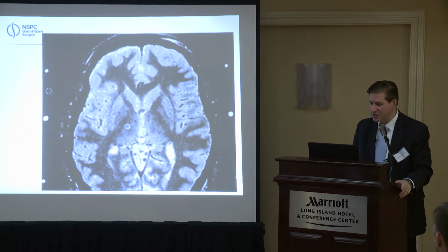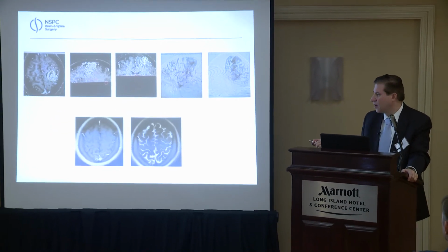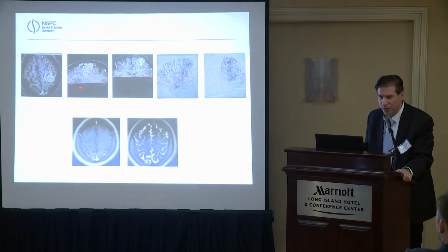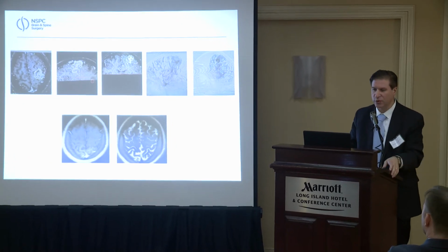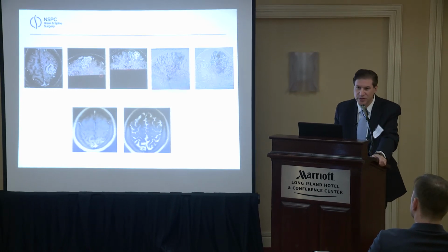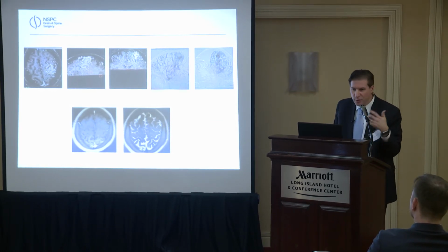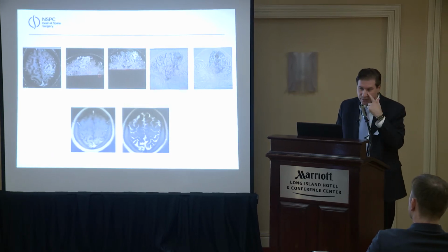The other thing I'll mention is cavernous malformations. Again, we see these a lot less commonly than brain AVMs. Gamma Knife can work also for dural AVMs, or carotid-cavernous fistulas if you couldn't treat them with neurointerventional methods. But cavernous malformations can also be treated. Again, these usually we leave alone. If they bleed, then I think they can be considered for treatment.